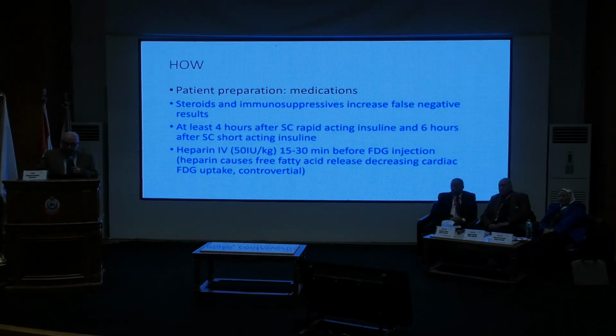What about medications? We said, of course, that antibiotics we cannot stop, but we prefer not to give steroids before the study because it can lead to false negative. It will lead to decreased inflammation. If we are going to inject insulin, we should not inject FDG at least for 4 hours after subcutaneous injection of rapid-acting insulin or 6 hours after subcutaneous injection of short-acting insulin.